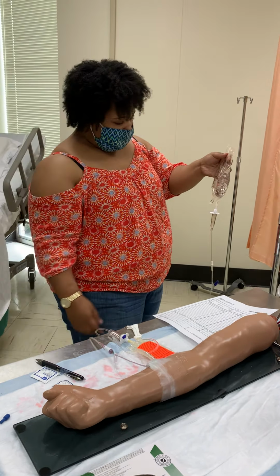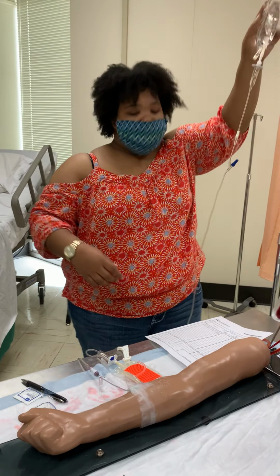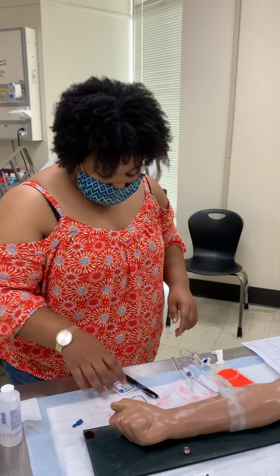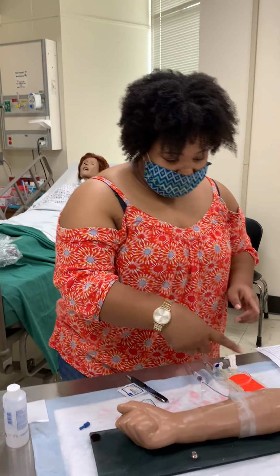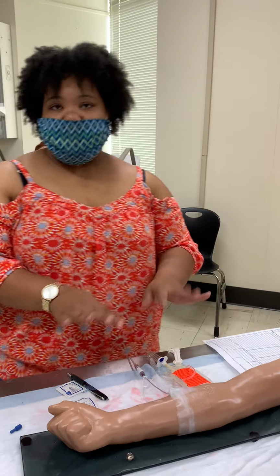And so I see that it's patent. Okay. So now I'm going to wash my hands, and I'm looking at their site to make sure that it's dry and intact and patent and everything.